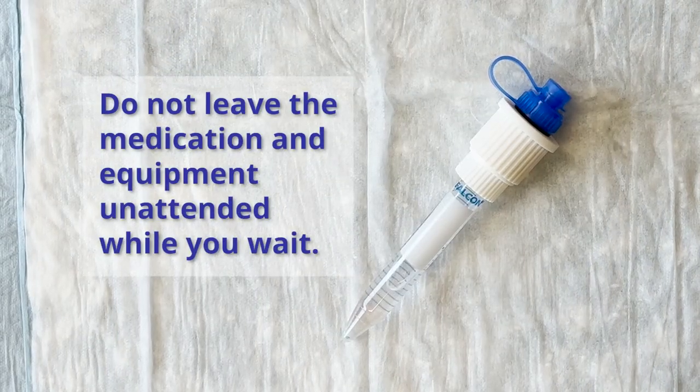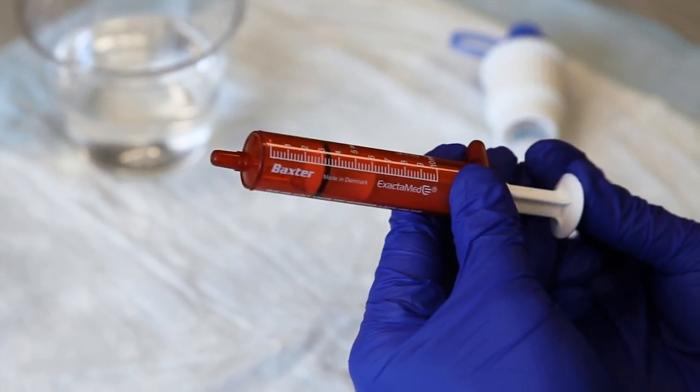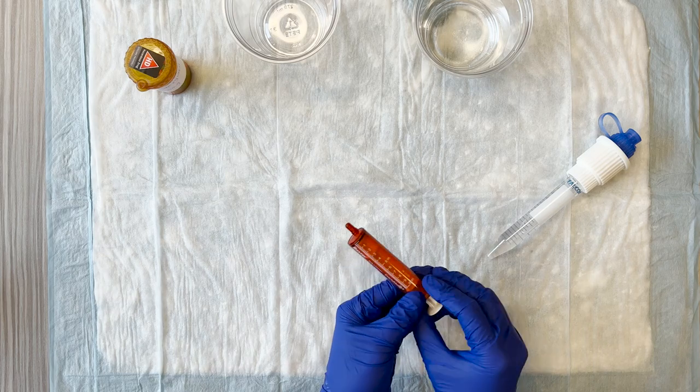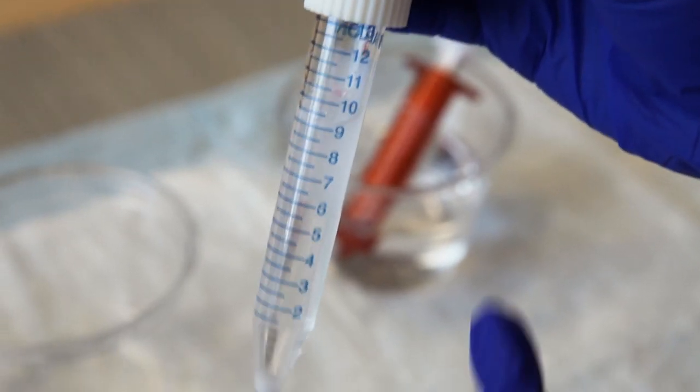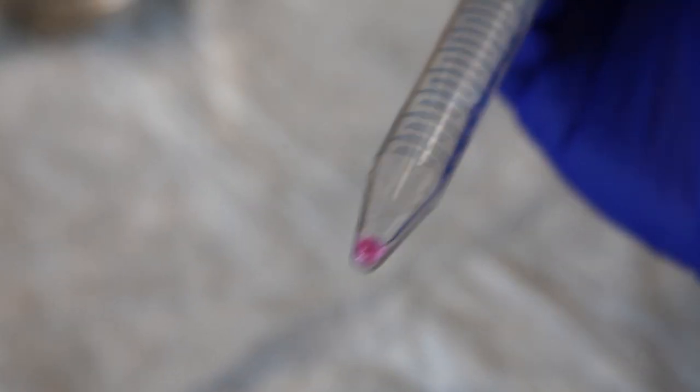Let it sit for several minutes to allow the capsule contents to dissolve fully. Do not leave the medication and equipment unattended while you wait. While waiting, make sure the plunger of the oral syringe is pushed all the way in. Once the solution is ready, use it right away. You may see bits of the capsule floating in the liquid — this is okay, as they will not fit into the syringe.